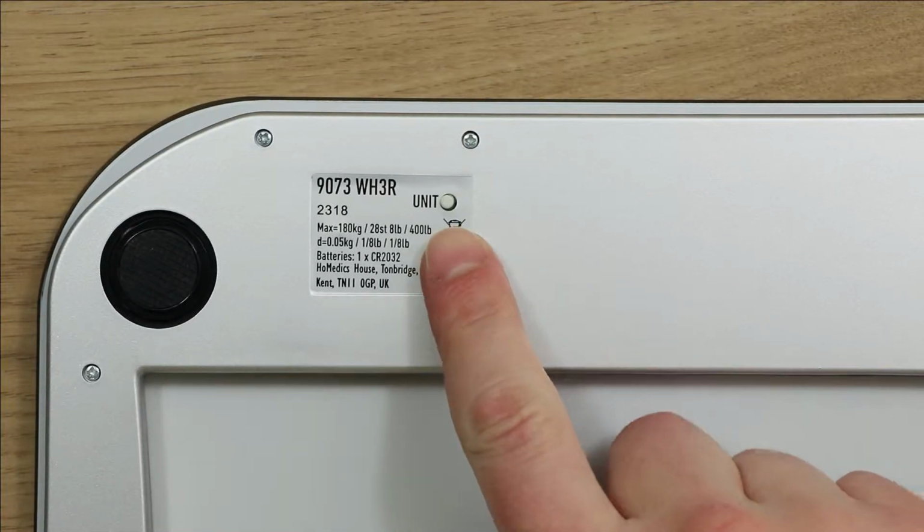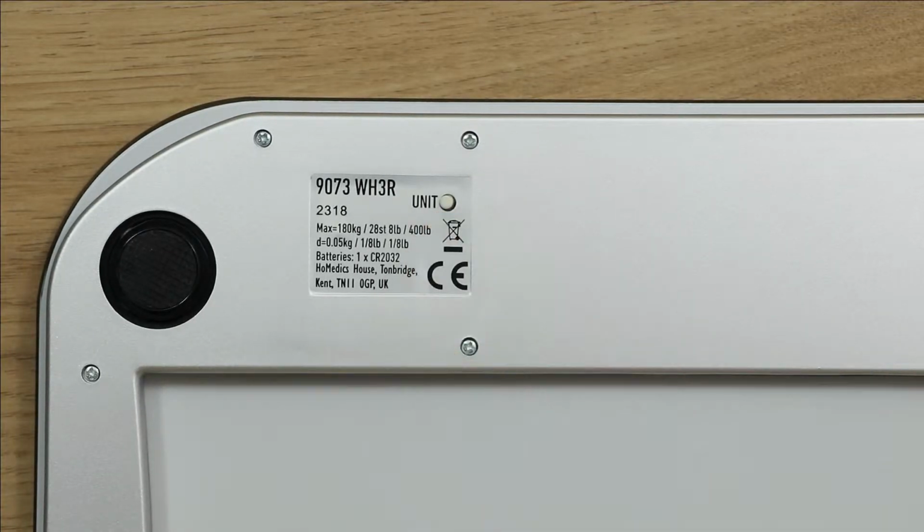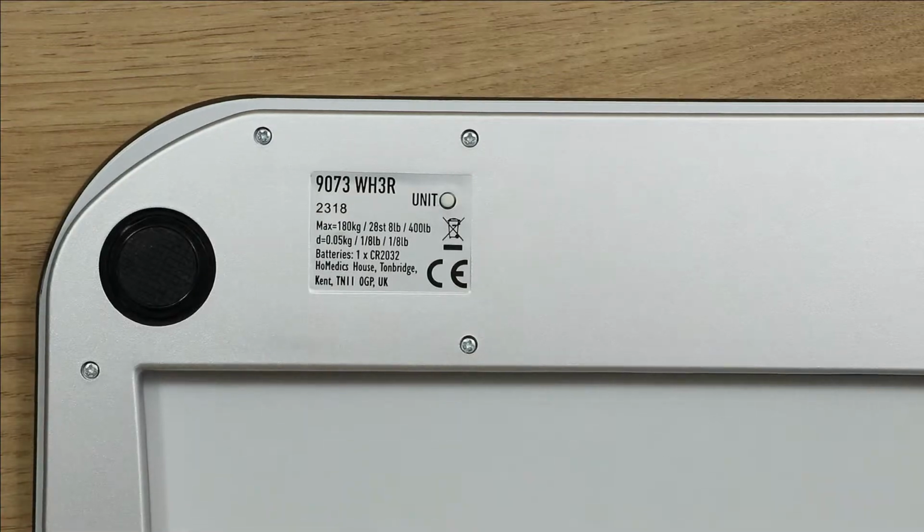There's also a little button here labelled unit, and you basically press that to switch the scales between the units that it shows on the front on the LCD screen. So if you want kilograms or stones and pounds or just pounds, that's how you toggle between the available options.